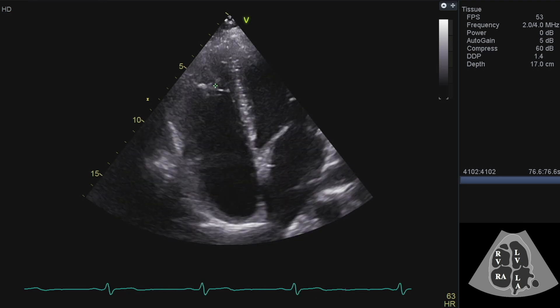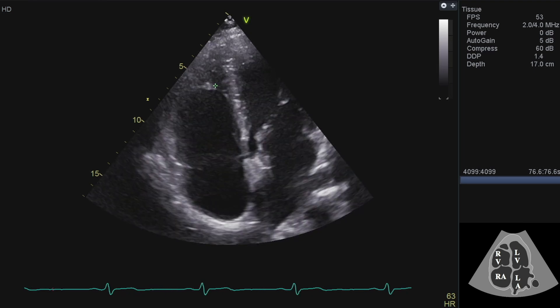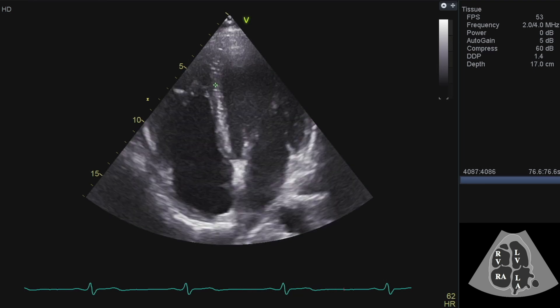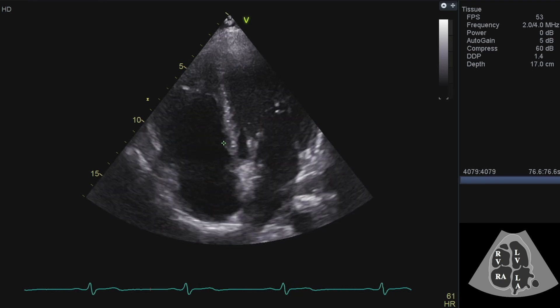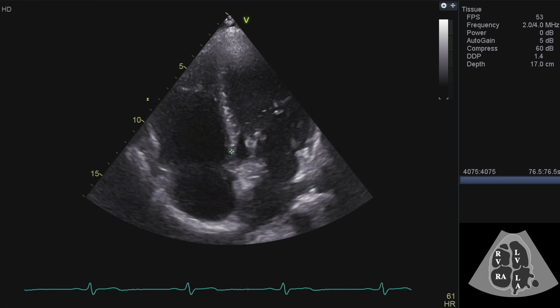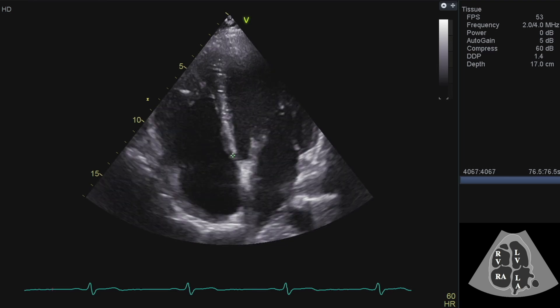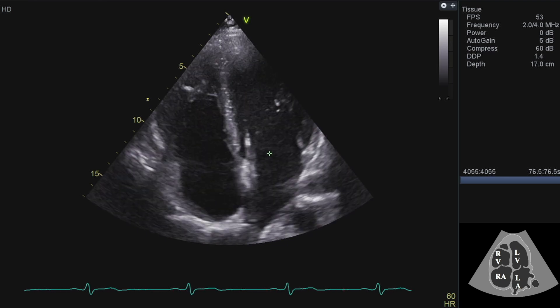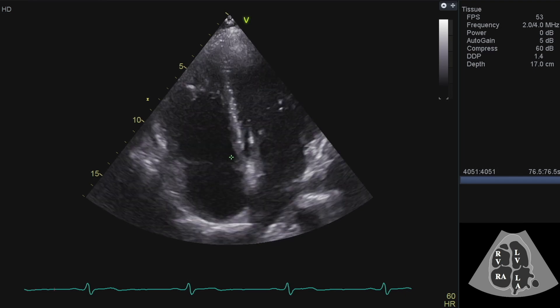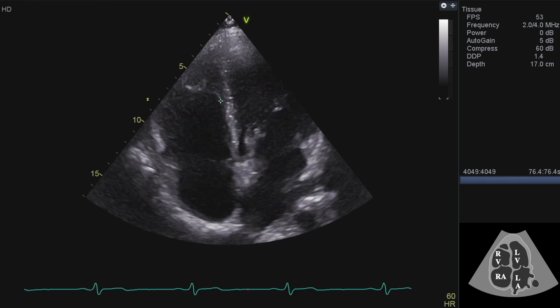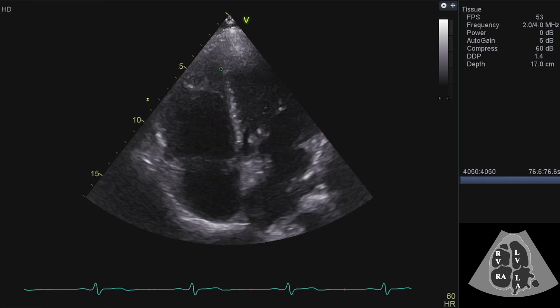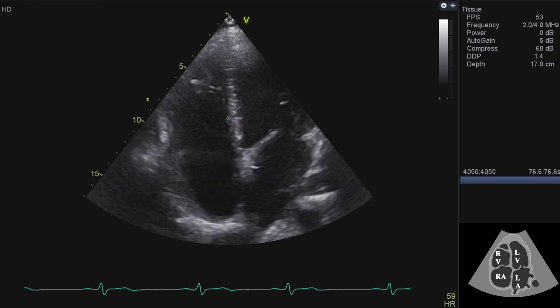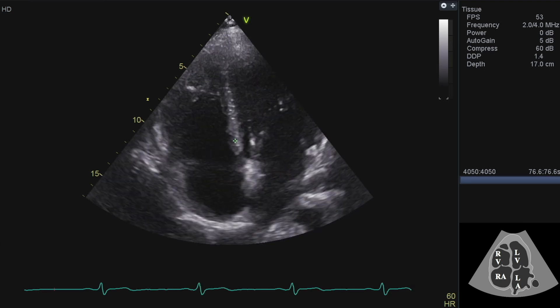This is what a normal right ventricle looks like. Another thing I'll be checking whilst I'm on the right side is the relative positions of the two valves — the tricuspid and the mitral valve. We expect the tricuspid to be nearer the apex than the mitral, which you can see here. It's only a small offset, and that's fine.